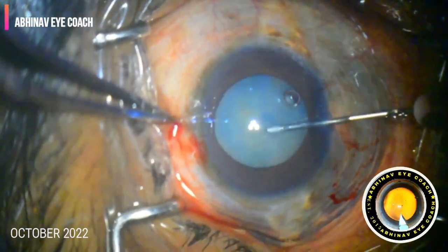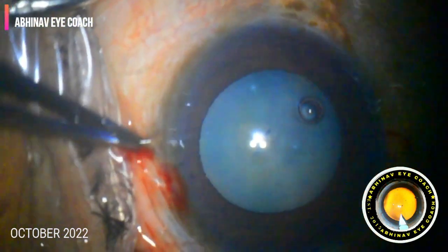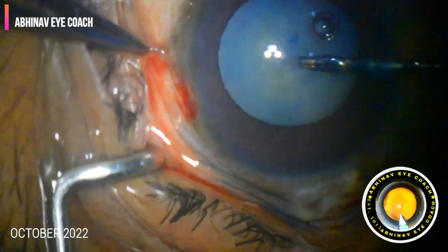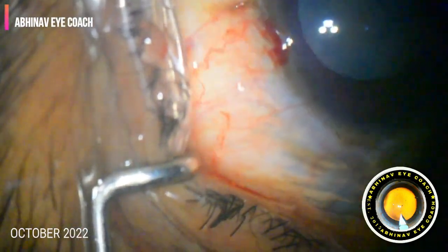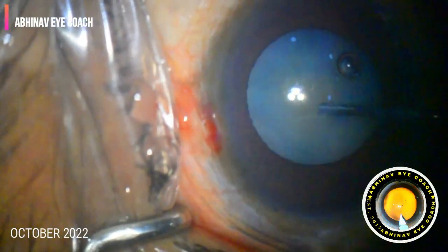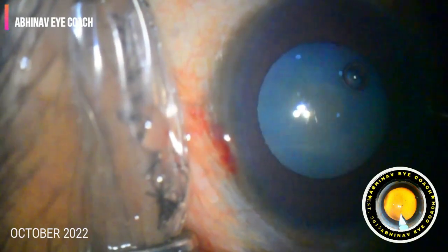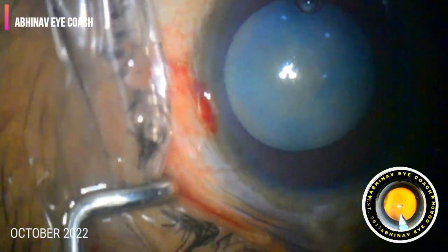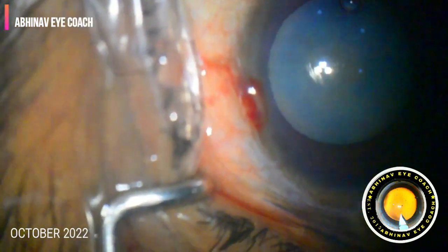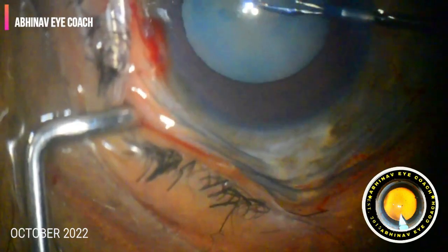Then we stained the anterior capsule with dye and injected viscoelastic inside the eye. We started doing the capsulorhexis. Initially we planned with the double rhexis technique, so we made a small rhexis intentionally, and later, after releasing some intralenticular pressure by rocking the nucleus, we gave a small nick to extend the rhexis into a bigger one.